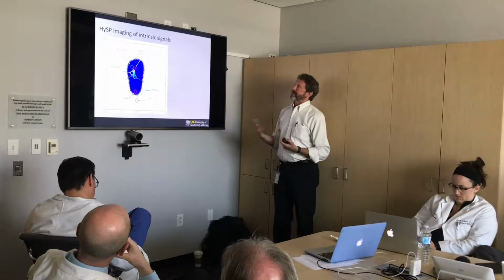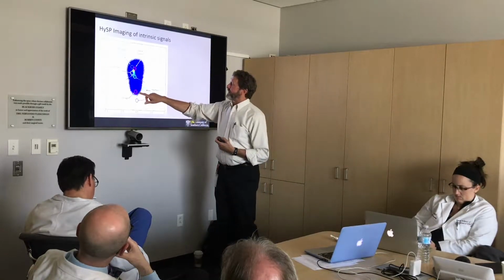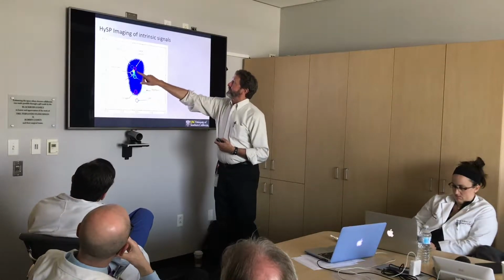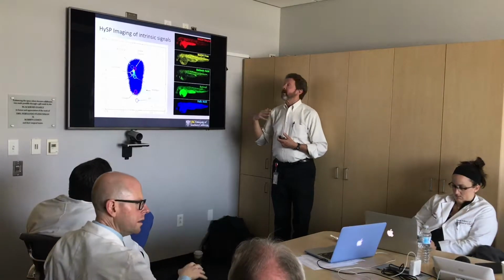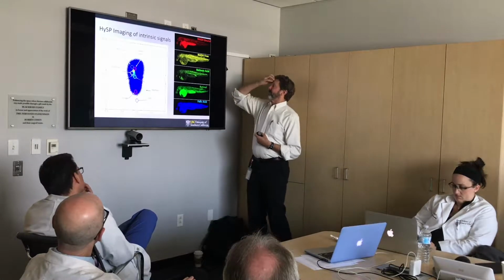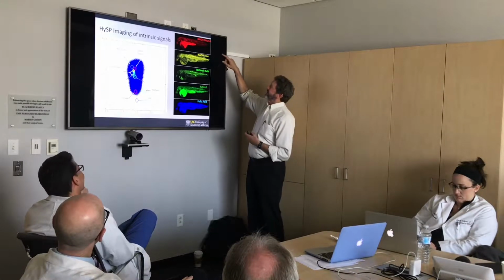Can we also see things that are there in autofluorescence? As we start looking around, you can see signals like the autofluorescence of the collagen, things like NADH bound and free, folic acid, a whole bunch of things. If we look in the animal, it's always easier to get informed consent out of the zebrafish.